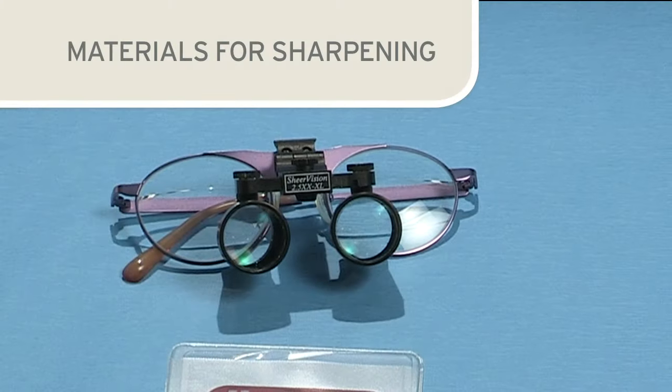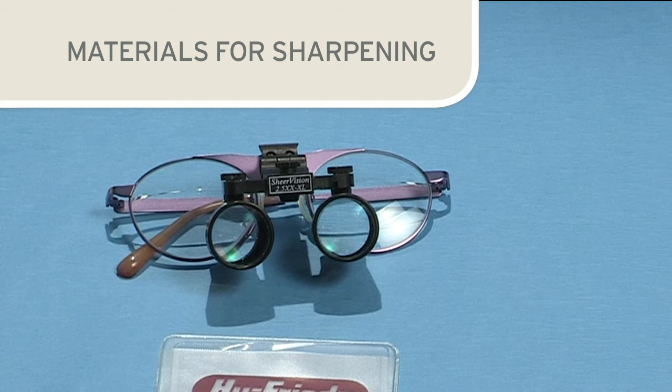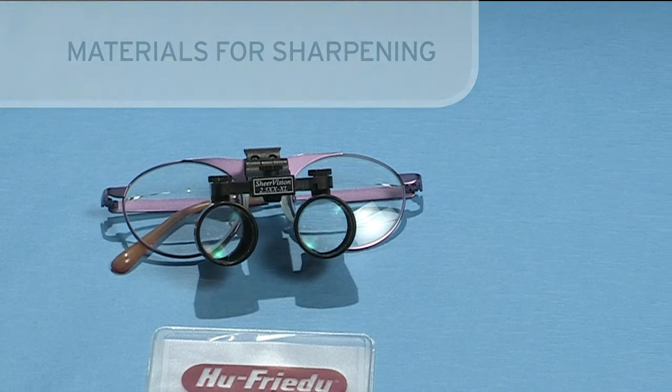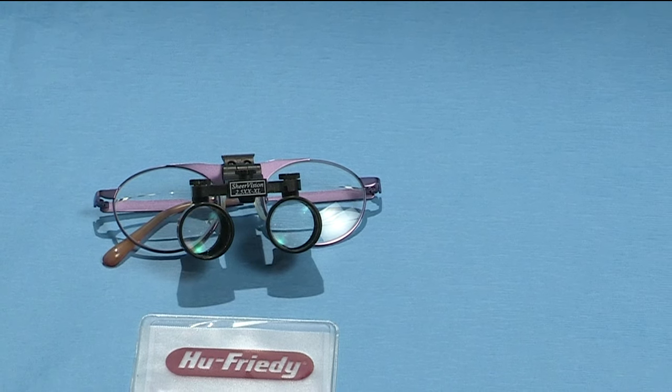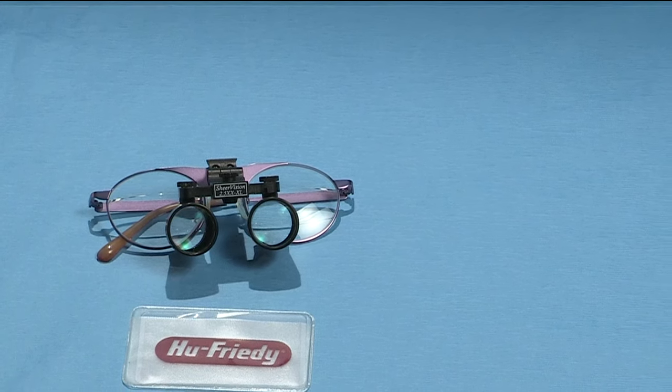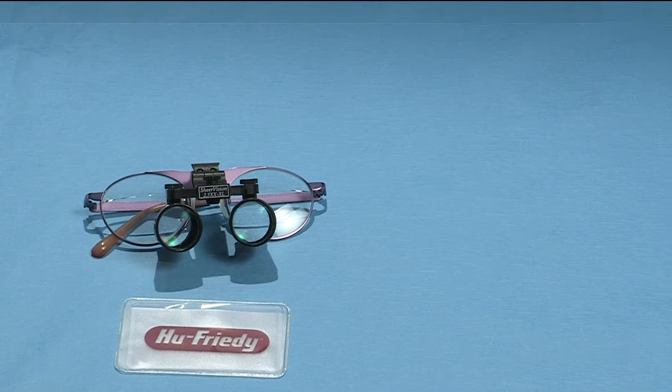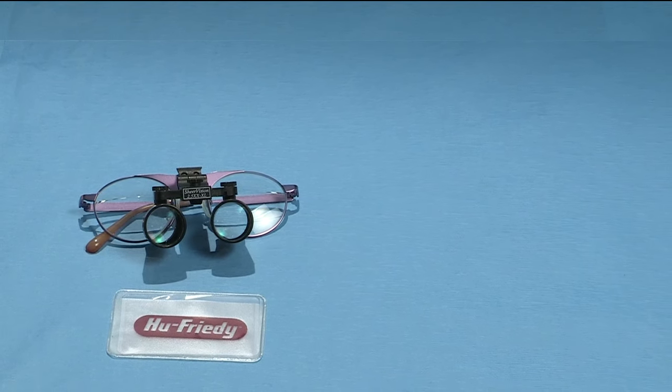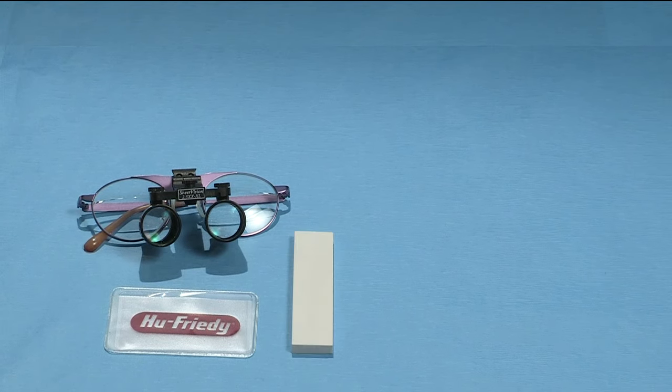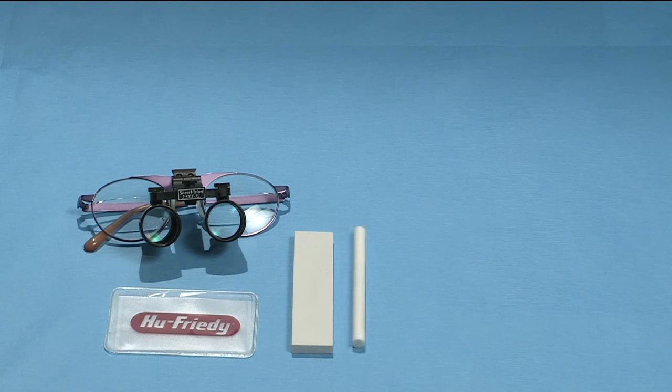Before beginning the sharpening process assemble the required materials. A sturdy flat work surface with proper lighting is essential. The use of loops or magnifying lens is essential to clearly see the edges of the instrument blade. Also needed will be a flat sharpening stone and a cylindrical stone.